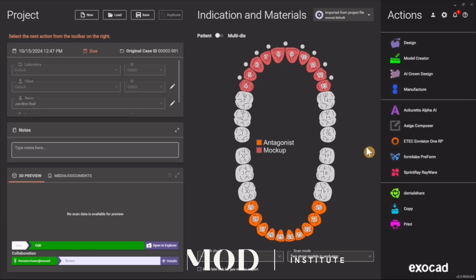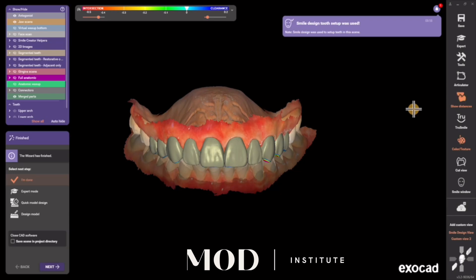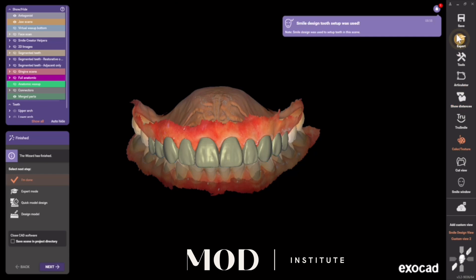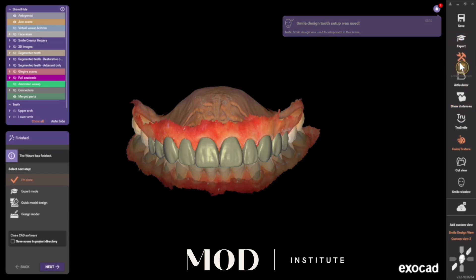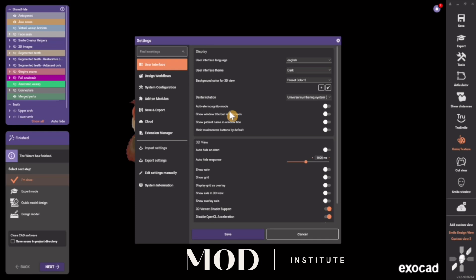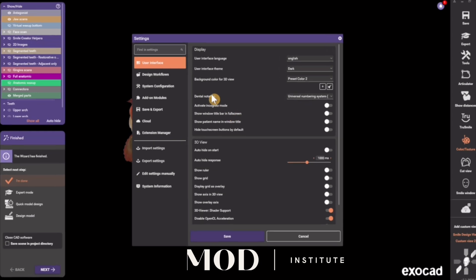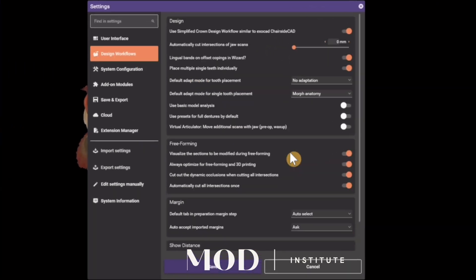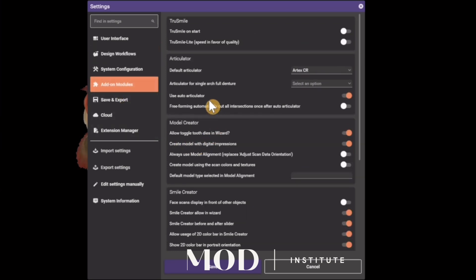In addition to that, there are some settings to change in the DentalCAD app. Go to Tools > Settings. The first thing I would do is go to Add-on Modules and turn on Use Auto Articulation — that's going to save you time and automatically do dynamic articulation.